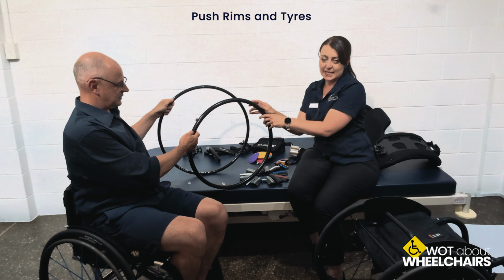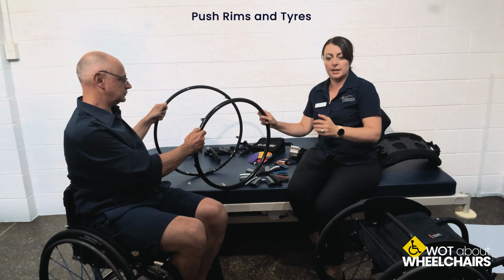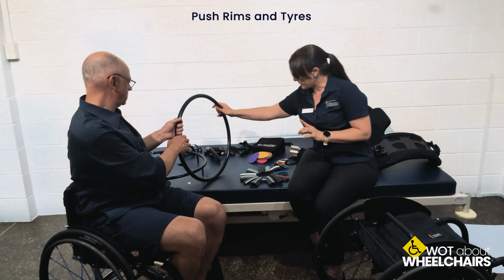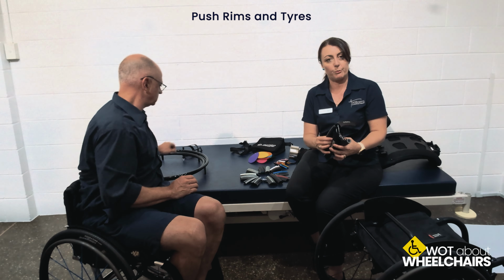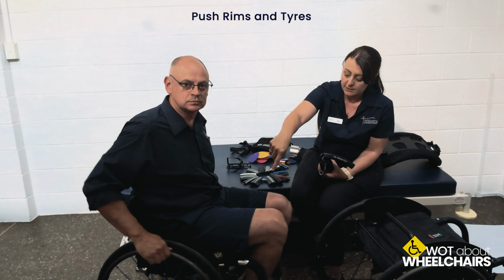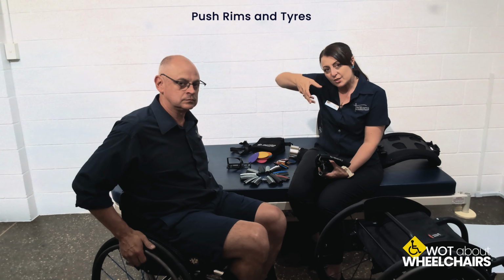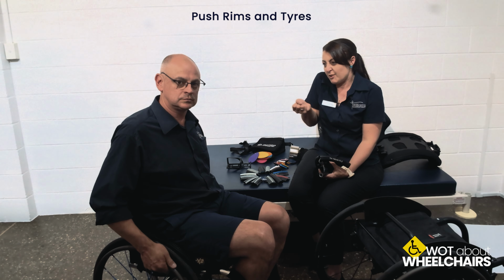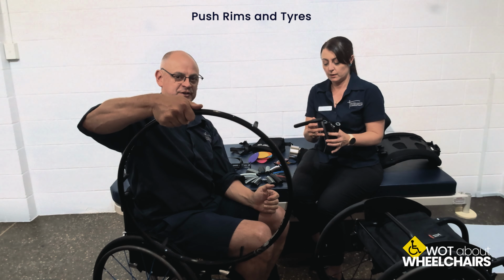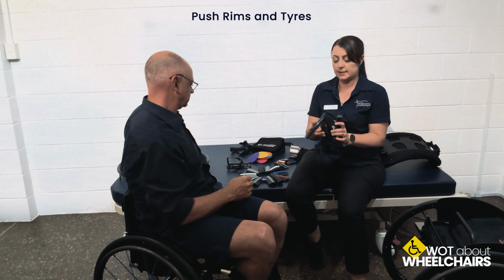That one offers grip and support. But this one, I can't remember the official name for it, has a tacky feel. It's got a rubber covering on it, and it means that you can grab the wheel much easier. It's not as slippery, much easier to grip. So that's another option. But we do have some other versions as well. The push rims that Brad's got are a circular design in terms of the steel tubing, so you have to have reasonably good grasp to be able to grab that. Yeah, it's a cylinder. Thumb quite often goes on top, and you're using the grip of your hand like holding a tube.